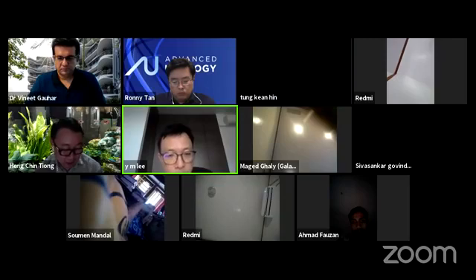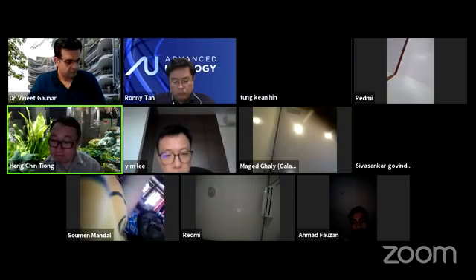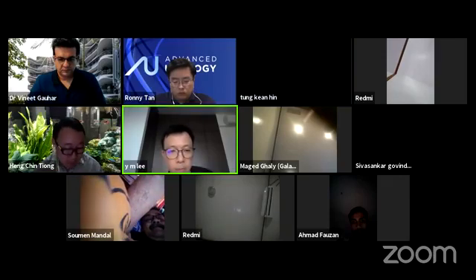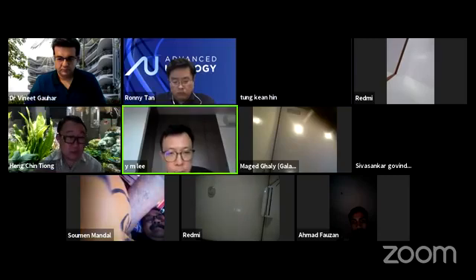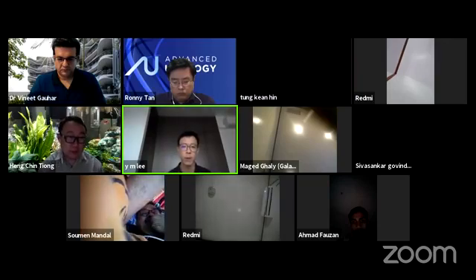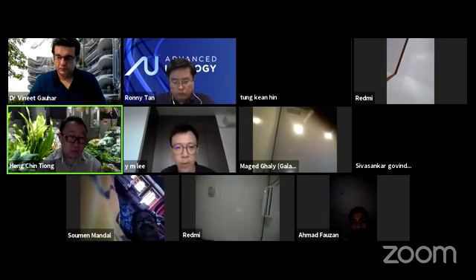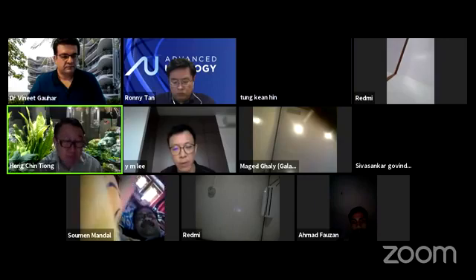Yeah. Okay. Any specific mention about median lobes? No. Just the size of the prostate, right? Yeah, because some of these cases may not even have had an endoscopic procedure, so we do not know. But on the MR images, you could see that even with IPP, it actually shows some reduction. Right. But I guess cases that don't have a very high grade IPP would probably do better when it comes to weaning off catheter. Right.